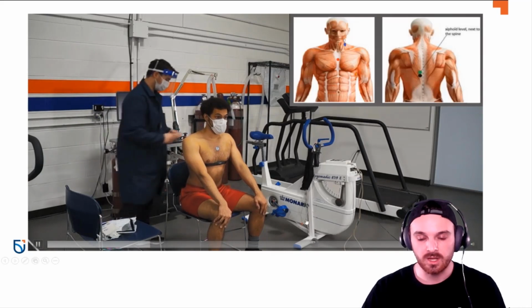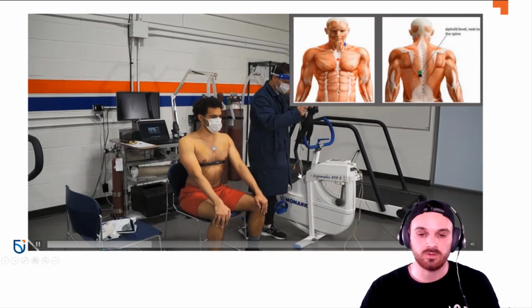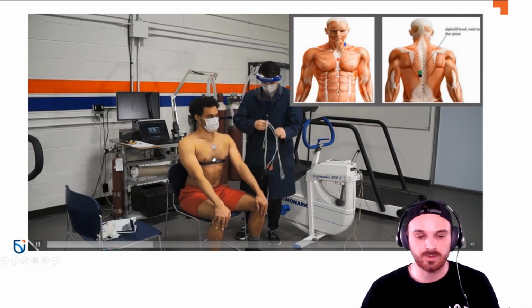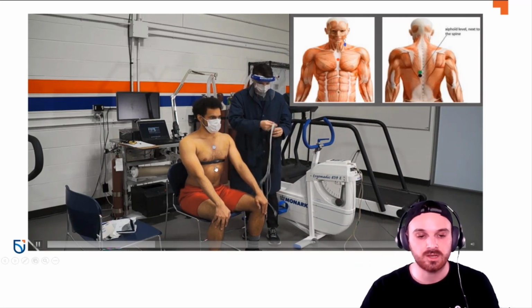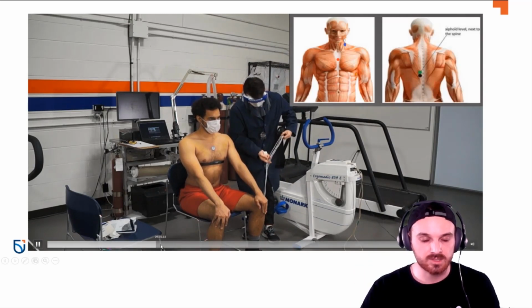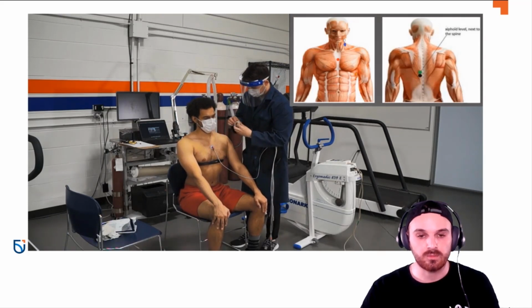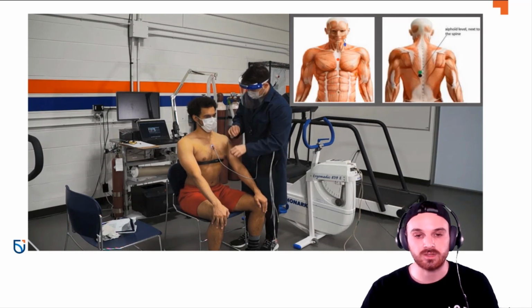Now those correspond nicely on the system here to the color-coded electrode leads, which are then placed on the participant. They snap onto the electrodes. They kind of bite onto the person, and you'll see that I'll snap those on. So you can push them onto the participant, and then I'll tape them over just to make sure that it doesn't fall off during the test.